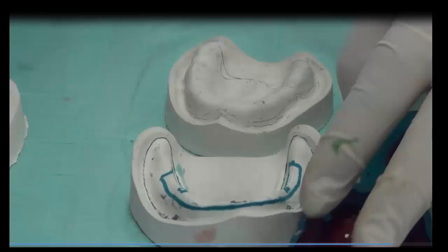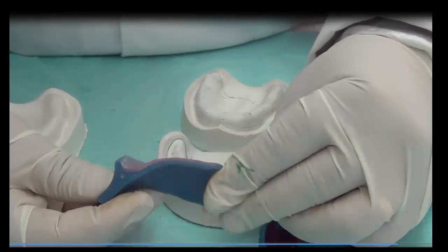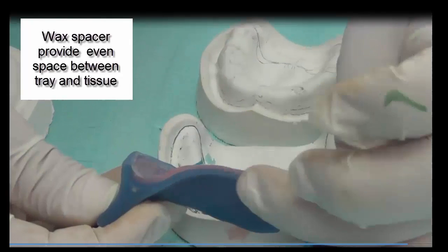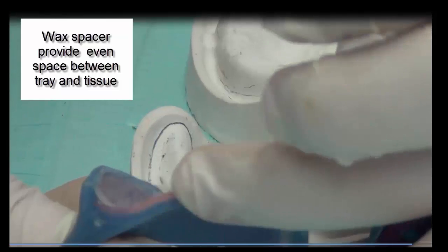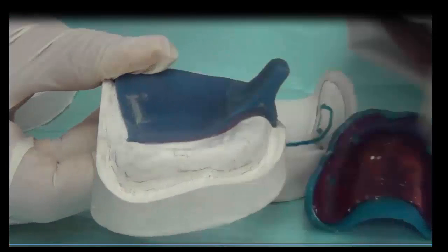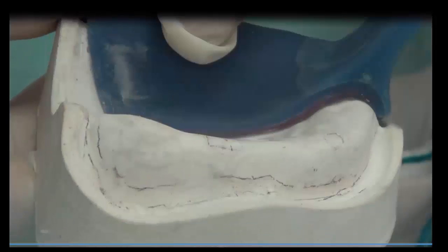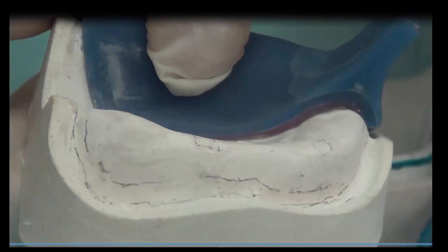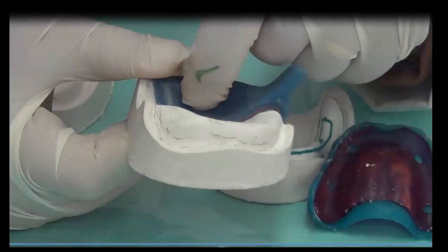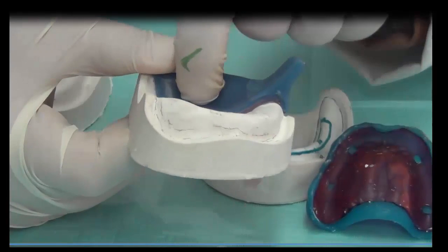If we look closely at the cross section here, this is what spacers provided. You can see that the tray material is adapted to the wax, and this wax is adapted to the cast. So if we look closely here, you could see that the wax provides space between the tray and the tissue. It's not closely fit. Wherever we have the wax, we will have this feature there. Now we're going to talk about, in more depth, types of relief and why do we need them.